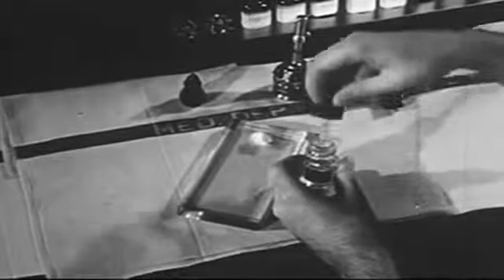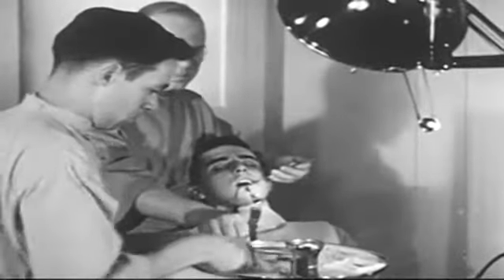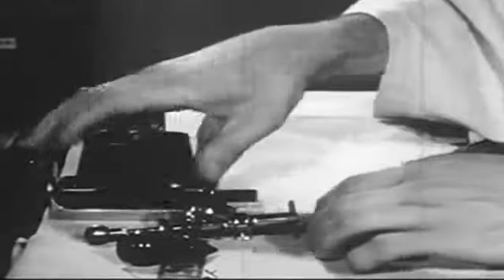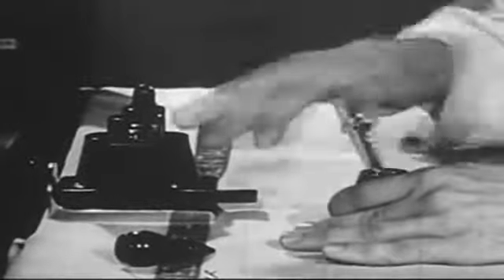This cavity will have an amalgam restoration placed over a lining of cement, which the technician now prepares. There are several types of cements and amalgams, and he must know how to mix every type. While the dental officer lines the cavity with cement, the technician mixes the amalgam.